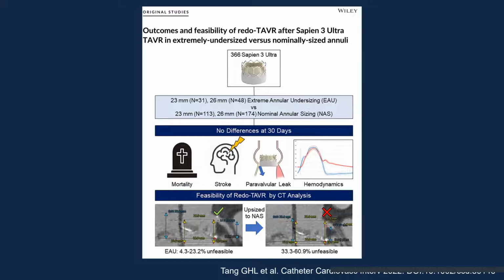So in terms of avoiding aortic root rupture or injury, we typically would true size or undersize a balloon expandable valve to avoid that, and you can always overexpand this without potential risk of PVL or transvalvular AR.